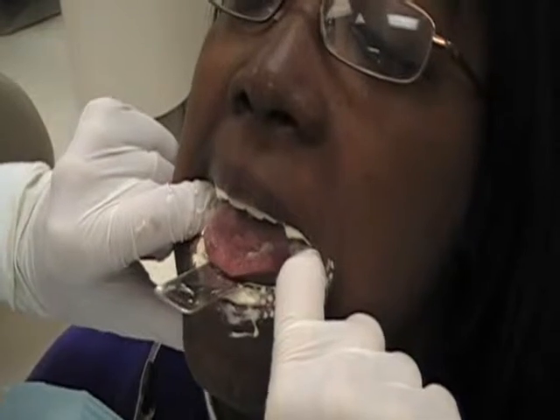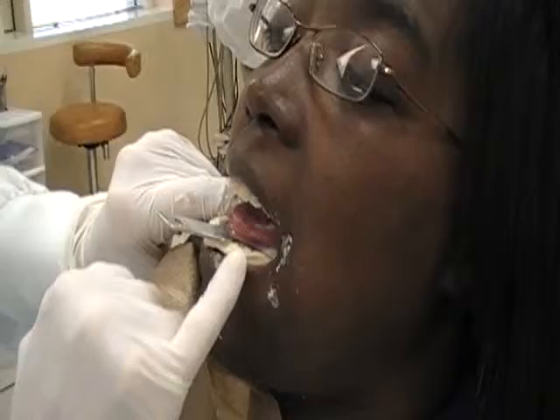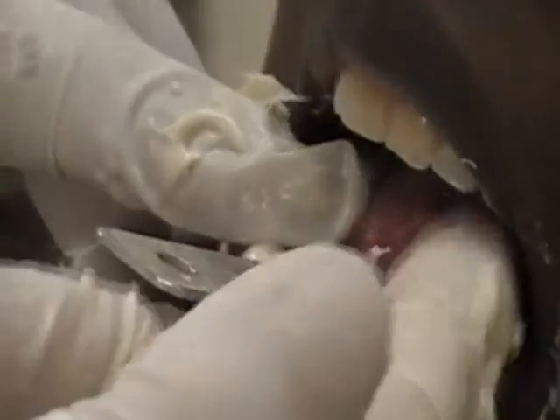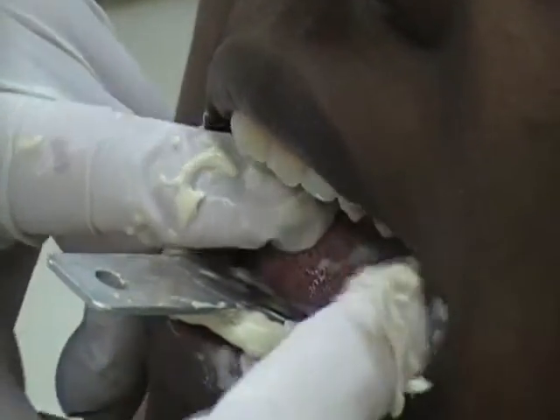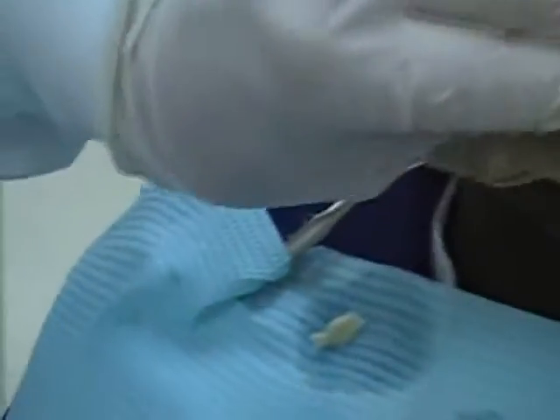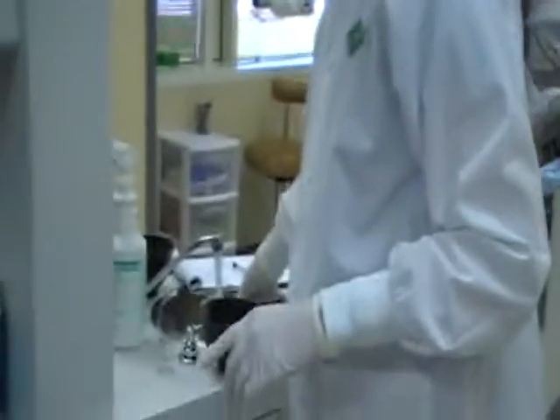The time from placement in the mouth to set is approximately two minutes. After about two minutes you can tell that the material is set — it feels fairly firm, like hard Jello. What you want to do is protect the patient's teeth before you remove it; you don't want to snap it up and hit the metal against her teeth. You also want to remove it in one very quick motion — break the suction release in one of the back areas, protecting her teeth, and then very quickly remove it. We have all of the teeth recorded. We'll give the patient something to wipe with, and the very next thing we do is rinse off the impression — any blood and saliva.